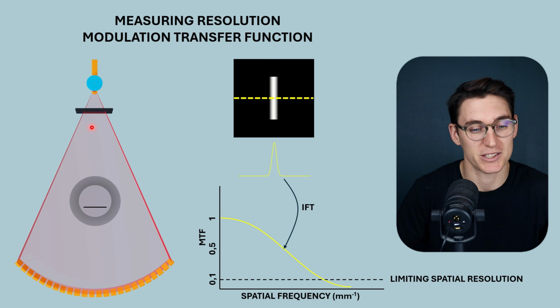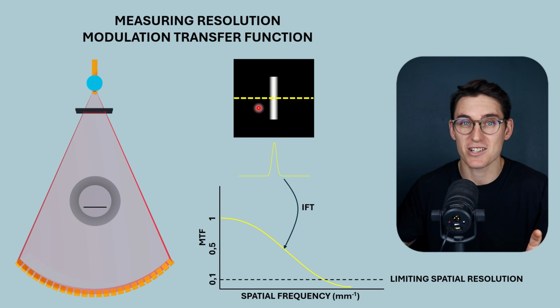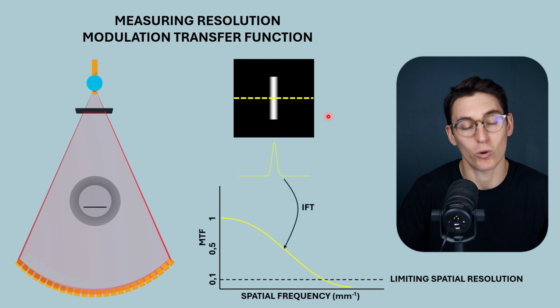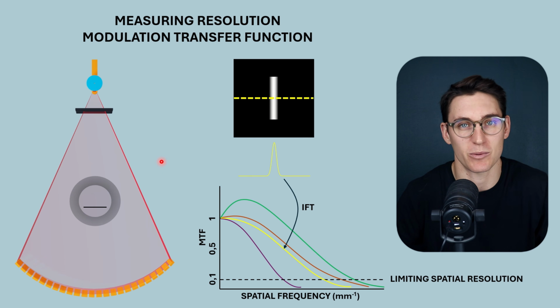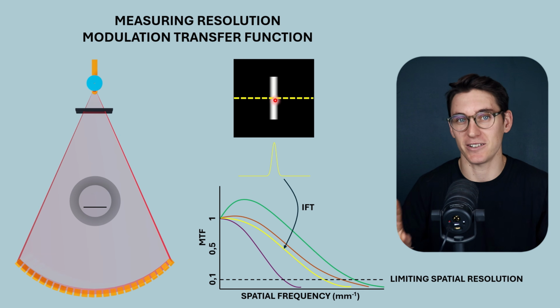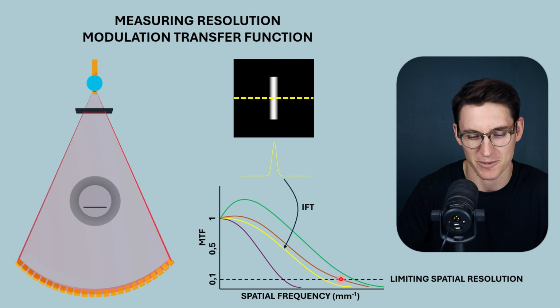Now we can change various parameters. We can change the type of image reconstruction we can do. We can change the filter that we apply to display our image. All of those changes are going to change the modulation transfer function or change the spatial resolution of our image. So you can see we can plot various different graphs depending on the parameters that we choose. And because the parameter changes that we're going to look at, the factors that influence spatial resolution, make spatial resolution in our final image different, we're going to get different modulation transfer functions. I hope that's not too confusing.